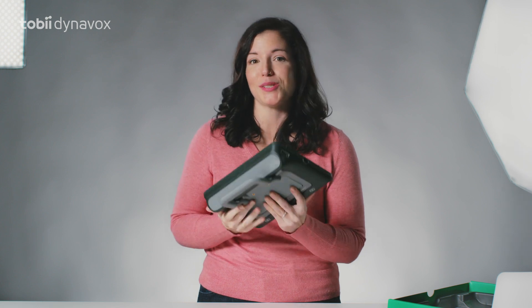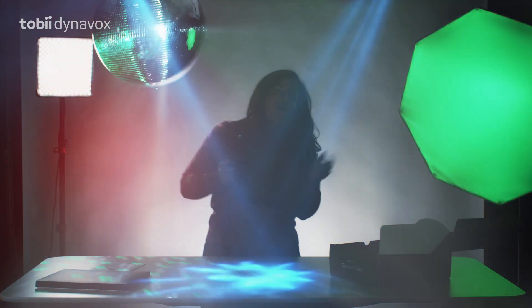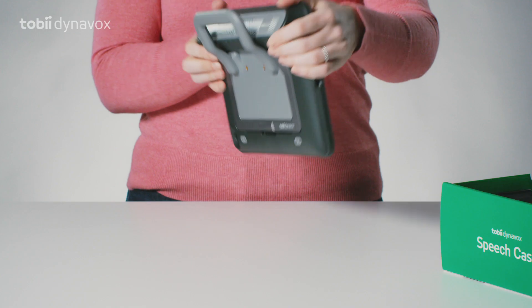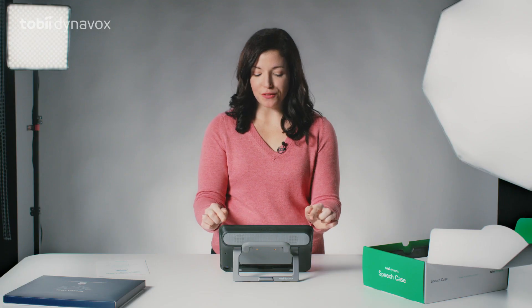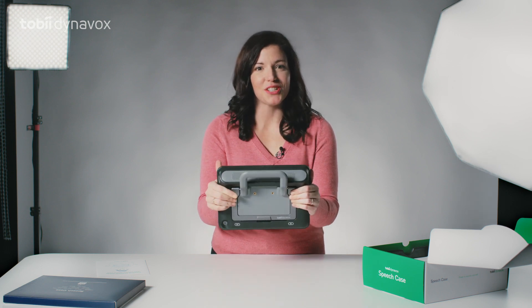Now your iPad is a powerful communication device. The speech case also has great speakers for clear and loud sound and it has the ability to be mounted to a wheelchair. It has a convenient kickstand and handle for extra grip. It also has reinforced crash corners for drops and has been developed to withstand the toughest conditions.